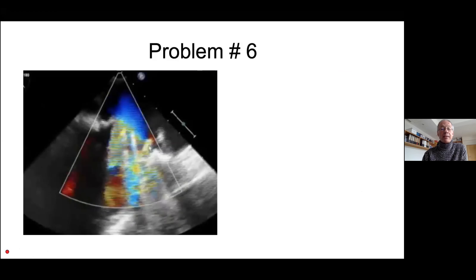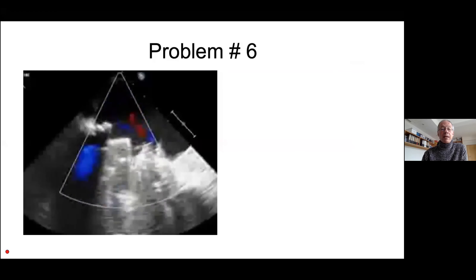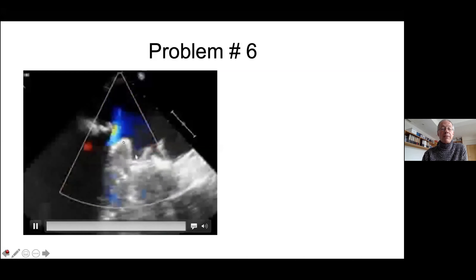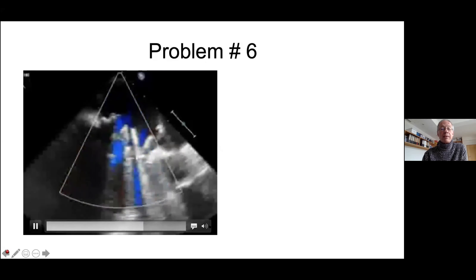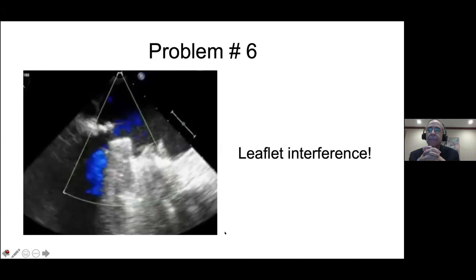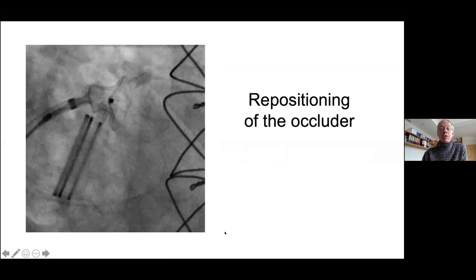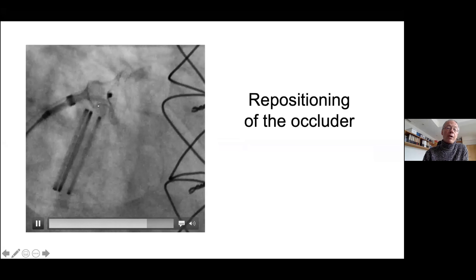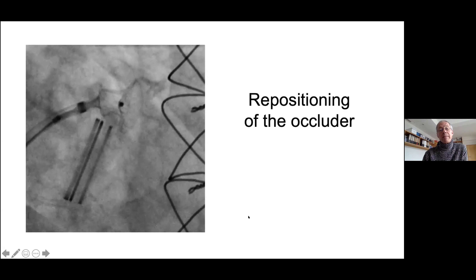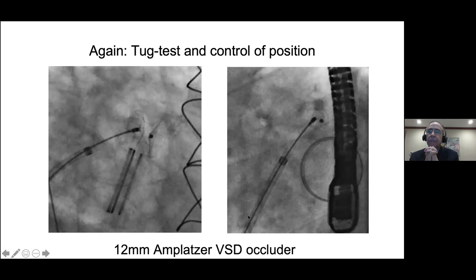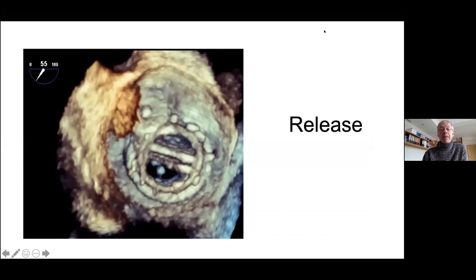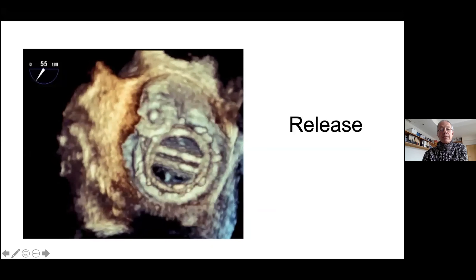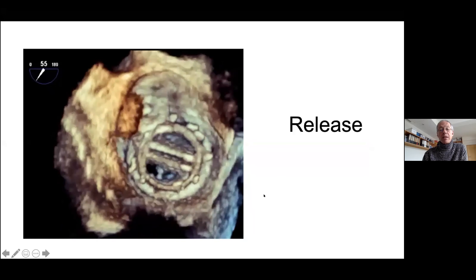But then we have problem number six. You can see on echo here — this leaflet got stuck. This one is moving, but now this one got stuck. That's something you should not leave. It was still connected, fortunately, so I just pulled it a little bit stronger into the defect and redeployed it. This is now a tug test again to confirm the position and stability of the device. Then the device is released, and you see the leaflets are moving freely. That looks good.